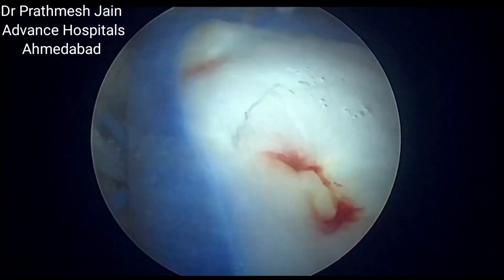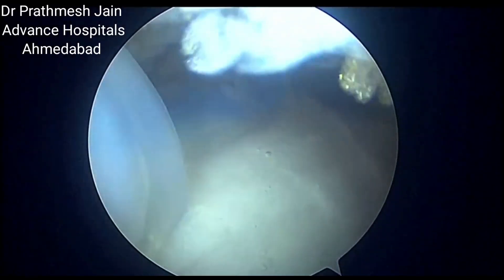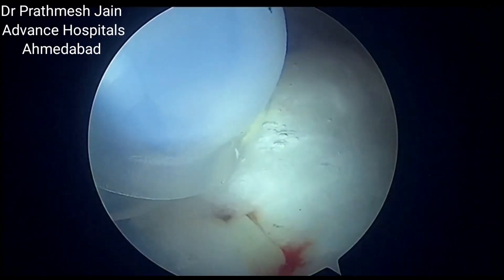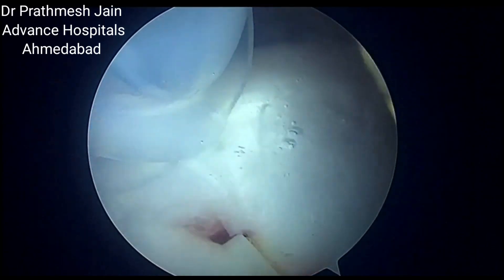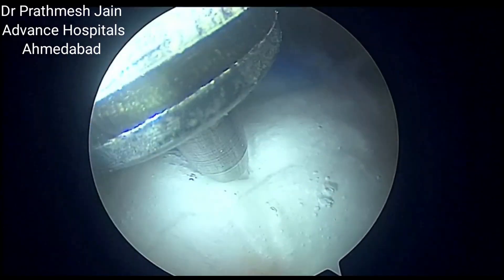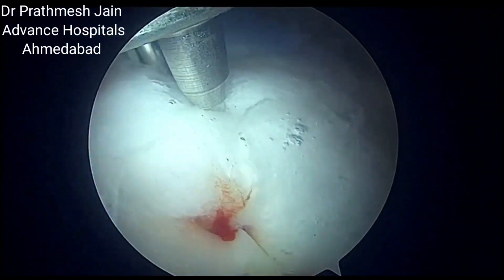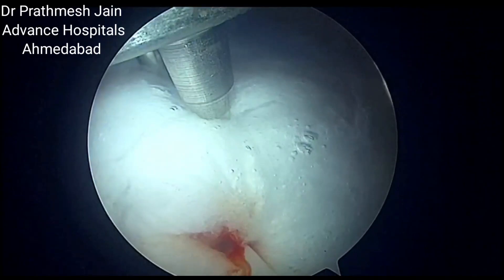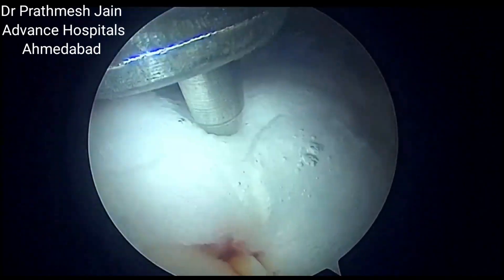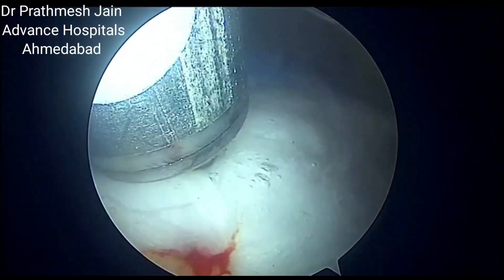After that, we will be placing our third peak anchor. This anchor is placed in the middle and will again be placed perpendicular to the patch. Once the anchor is placed perpendicularly after malleting, it is secured in position.